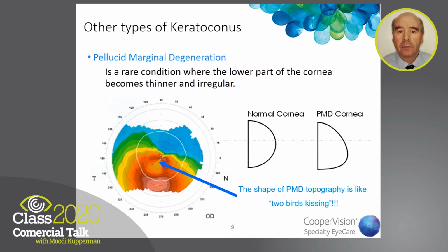What I suggest is always start with a topography, because when you do the topography, immediately you have the solution of what to fit.